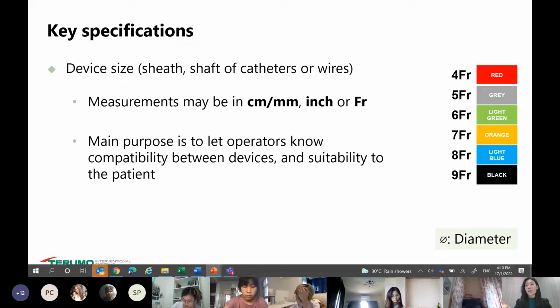Again, they don't want blood clotting to happen on the surface or inside the device, and for catheters, the tube devices, they don't want dead space inside. They want it to be wet throughout so that air will not be introduced into your blood, causing a blockage. Okay, so that's a very general thing about devices, about keeping and priming the devices. Later I'll go into more specific ones that talk about priming of new devices.